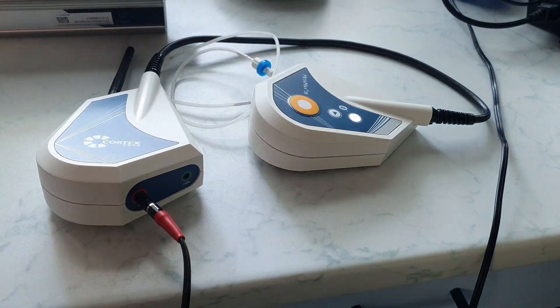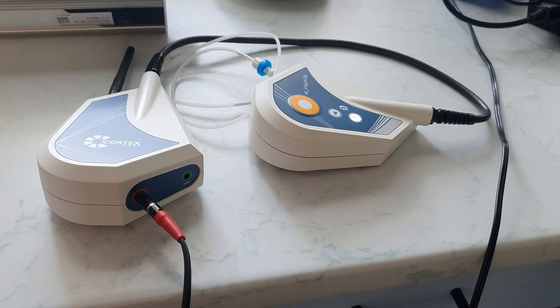The unit is switched on by pressing the power button once. This process can take a few minutes and is completed as soon as the unit lights up orange.